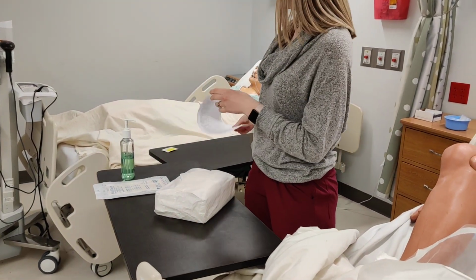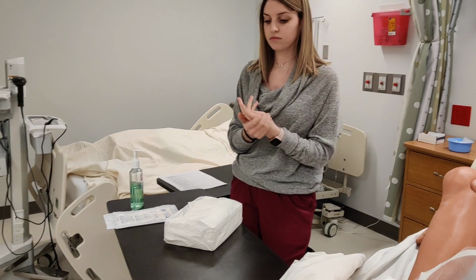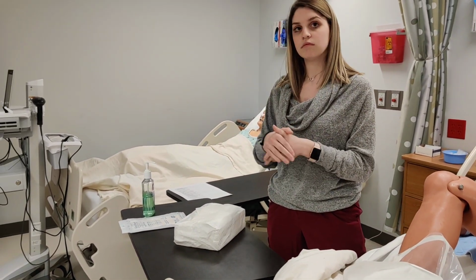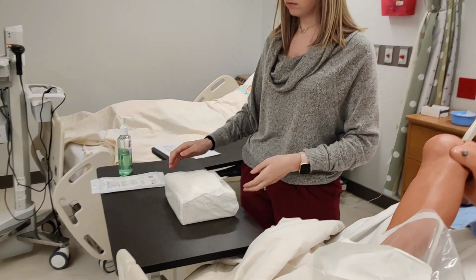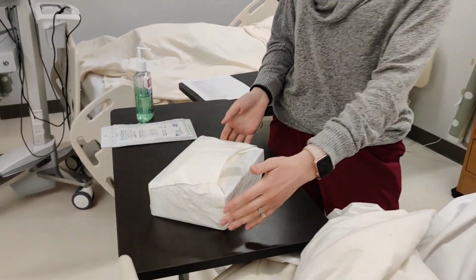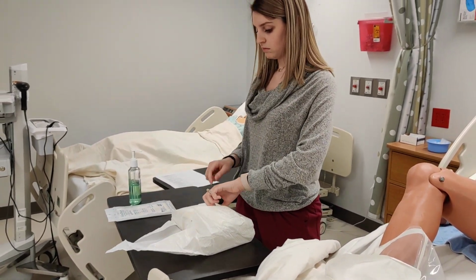The kit comes in a wrapper, so the exterior portion is not sterile. However, the interior portion is. So it's just like setting up a sterile field. So Gabby's going to open that up. There's a little corner that's sticking out, right? And that's the part that you're going to pull on to start opening that kit. With this, you still have that 1-inch border.